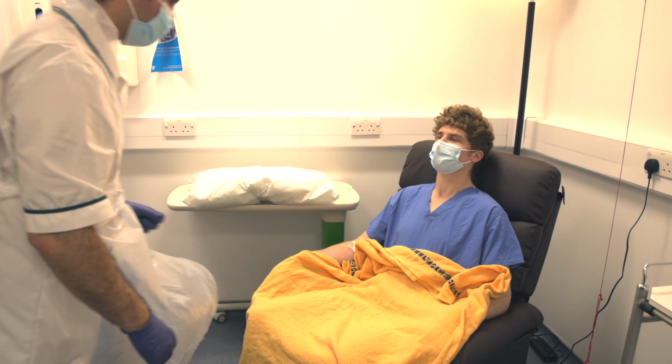The hospital I work at is a specialist cancer hospital, so today I'm mostly going to be talking about FDG in its use in finding cancer. These little bunches of cells will take up more sugar than the surrounding healthy tissue, and so we look for little bright spots on our pictures.